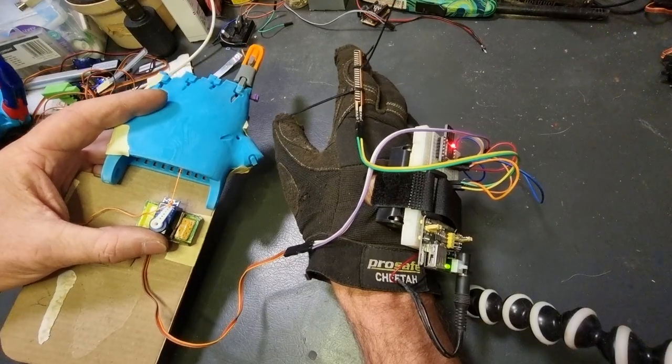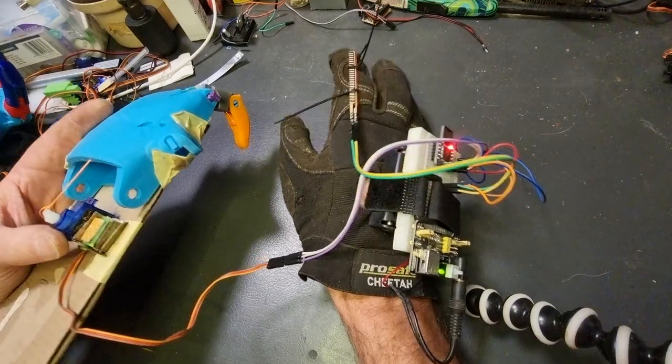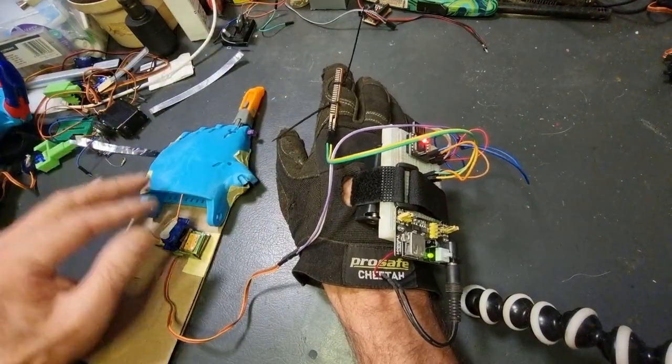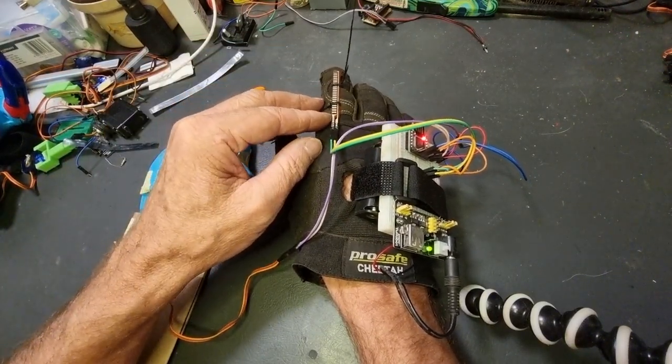It works pretty well. Obviously it needs a bit of adjustment and some work, but for a prototype it's proved the concept and it's working. We need more sensors for the other fingers, more servos, more fingers — all that sort of thing. The code is not my own; I will post a link to the code and credit the original author.